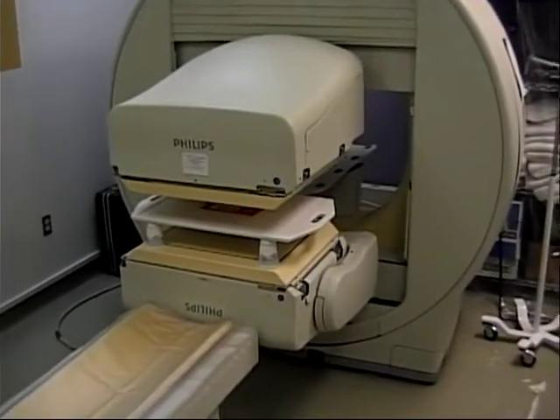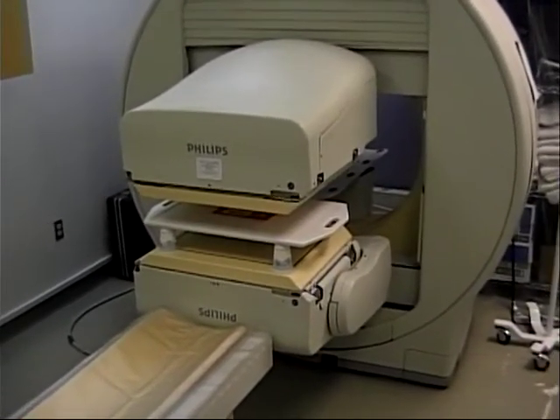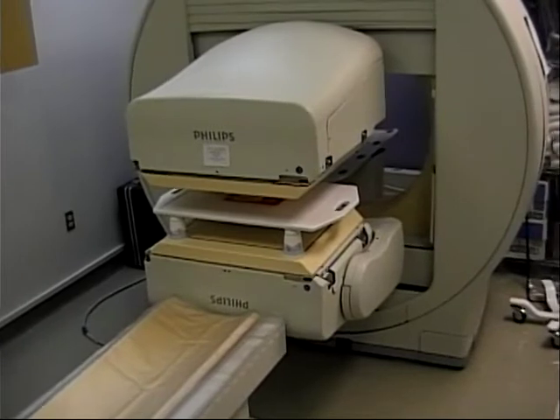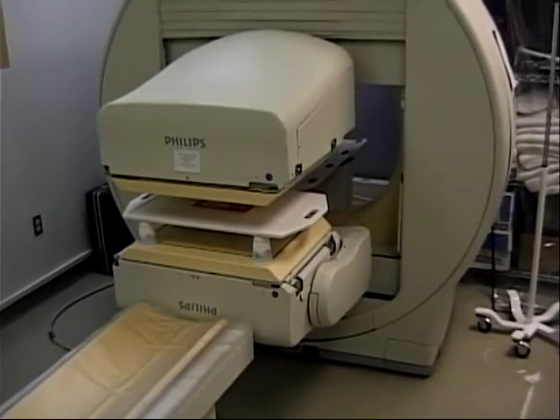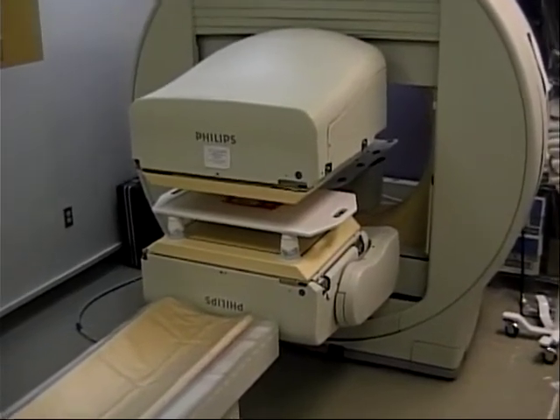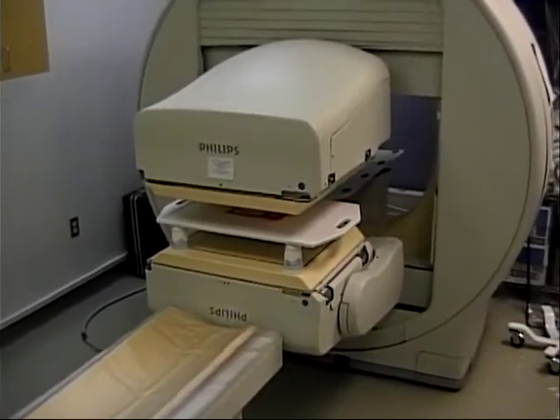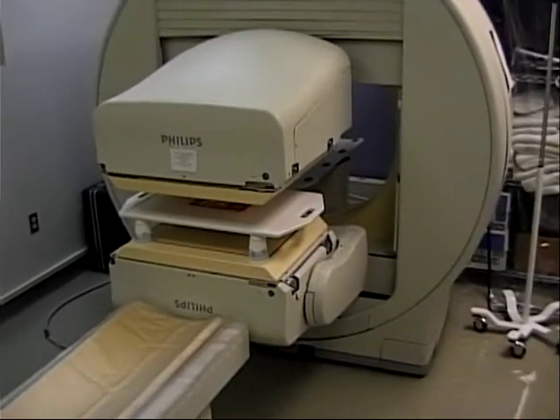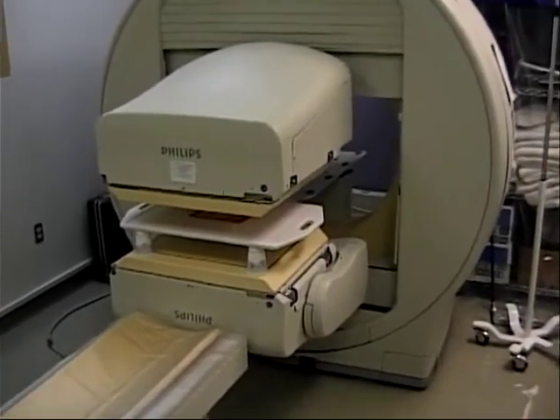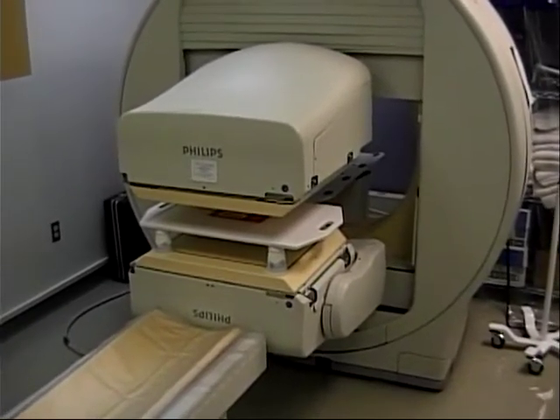That's not good to get water on our crystals because it'll help degrade our images by causing droplets to make formations in the crystal that make it so that the photons cannot completely go straight through the crystal as it would otherwise. Now, those crystals are hermetically sealed, and then they are coupled to the PMT tubes, ensuring that no moisture can actually get inside the crystal. Sometimes that seal is not as good as it should be and compromised, and our images can come up looking a little blotchy.